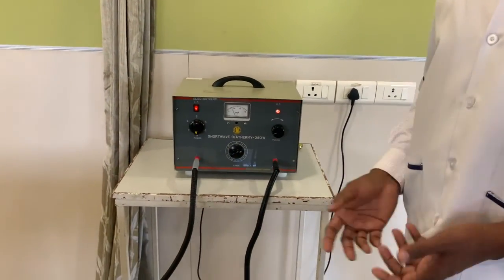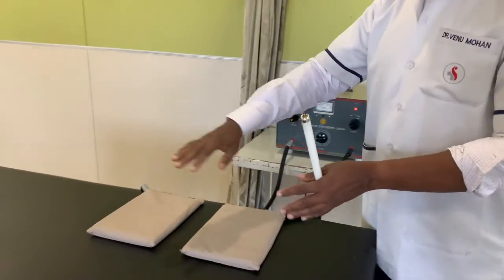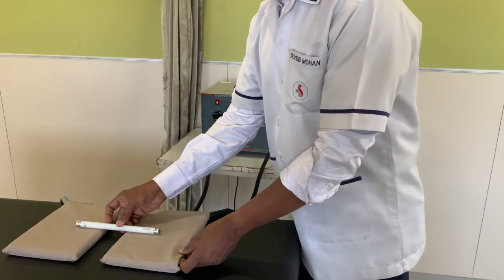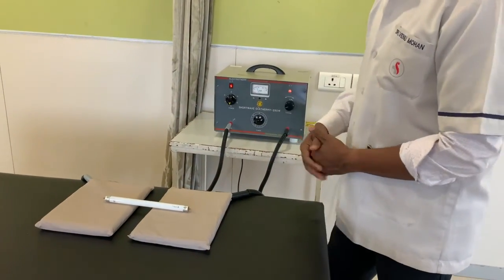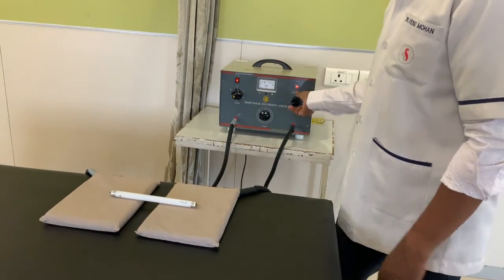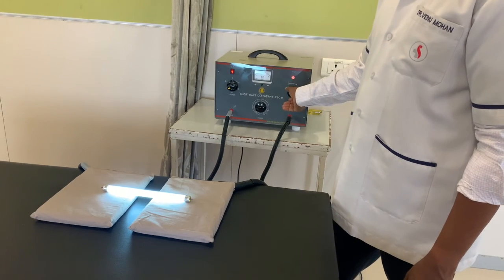The next method of testing is by using a fluorescent or neon lamp. For insulation you can place a towel on the electrodes, but for demonstration I'm not using the towel. I need to place the fluorescent lamp in the center of the electrodes, and I'll repeat the same. Switch on the machine, timer, the power, bring the power to 1, and I need to tune it. As you see, when I have tuned it, the bulb started glowing.